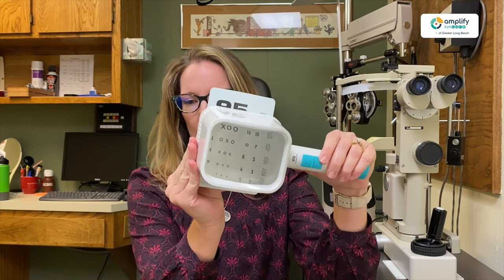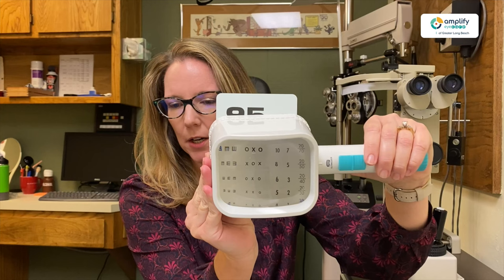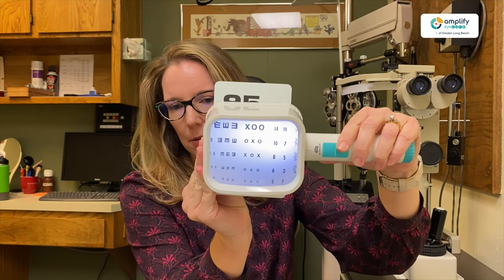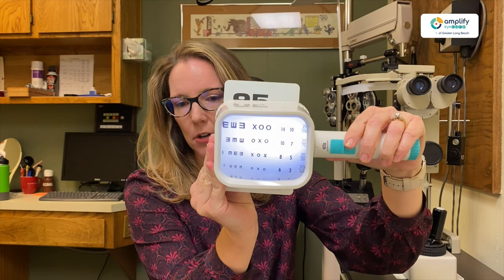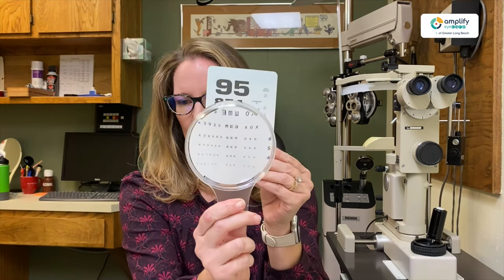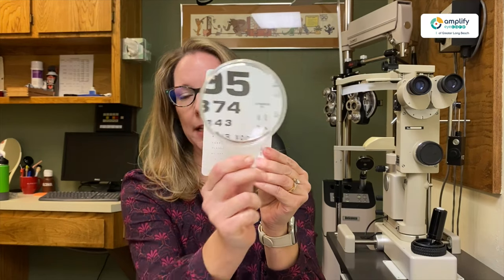The other good thing about a stand magnifier is that it has a light as well. Anytime you have an enclosed system like this, it's going to be better if it has a light in there, because otherwise you get very dim and it makes it a lot harder to see the words. Versus before, when we had the handheld, it's still okay because we have light coming around it.